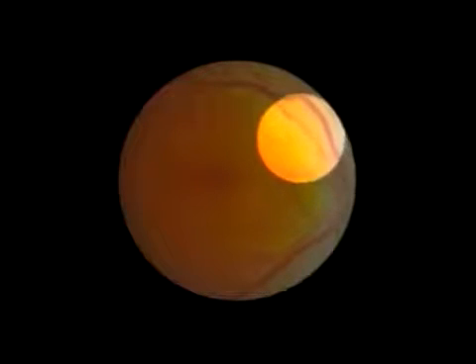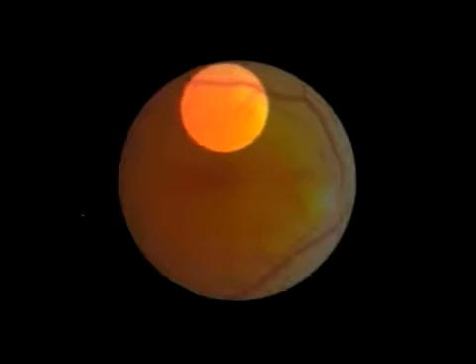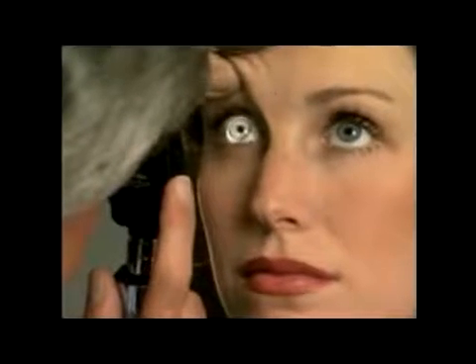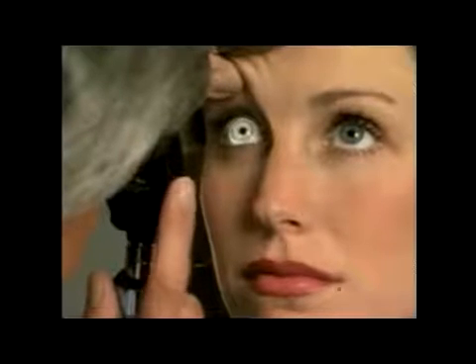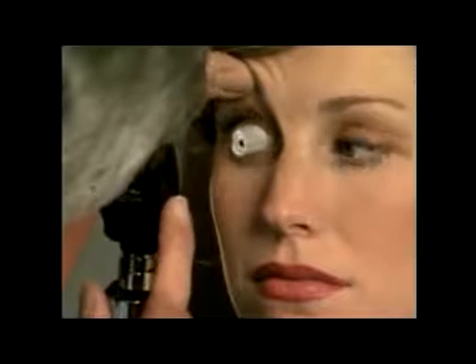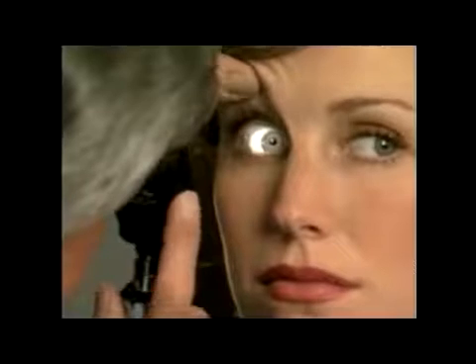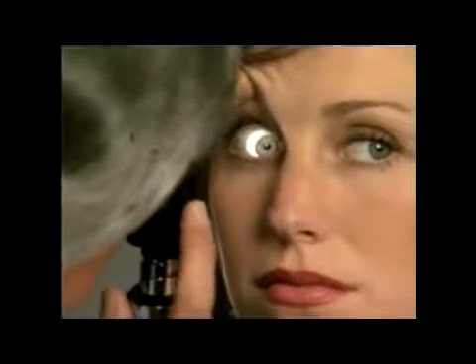Follow each vessel as far to the periphery as you can. Ask your patient to look up so you can examine the superior retina, look down so you can examine the inferior retina, look temporally so you can examine the temporal retina, and look nasally so you can examine the nasal retina.